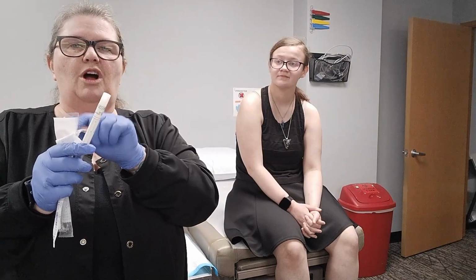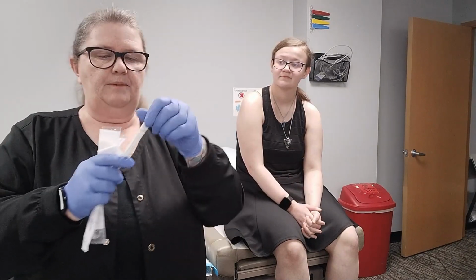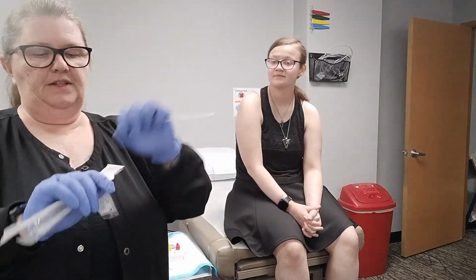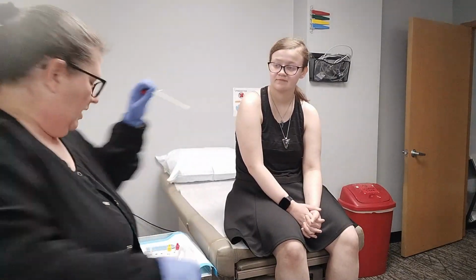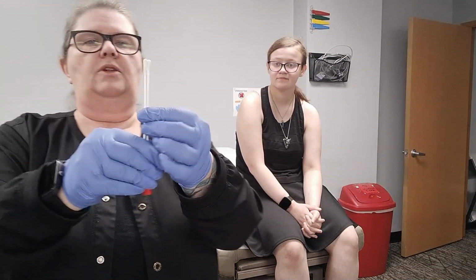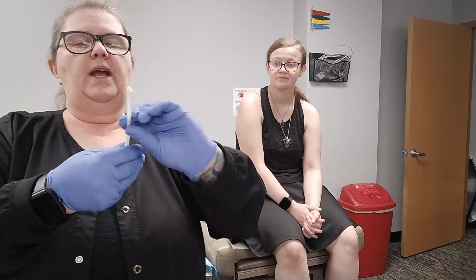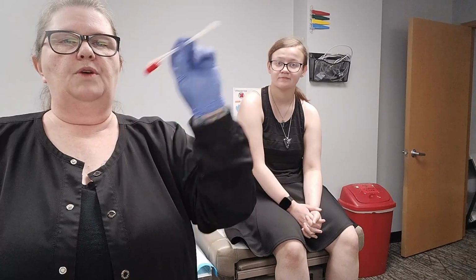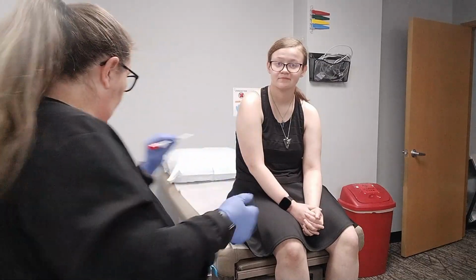I'm just going to twist it so that when I have this swab in my hand, I'm not fighting with it, okay? All right, I'm going to lay that down, and then I'm going to take this swab along with this swab, and we are going to just put them together like that, okay? This way I can hold them this way, and I can swab her throat with both at the same time, again, so I'm not having to do it twice, okay?